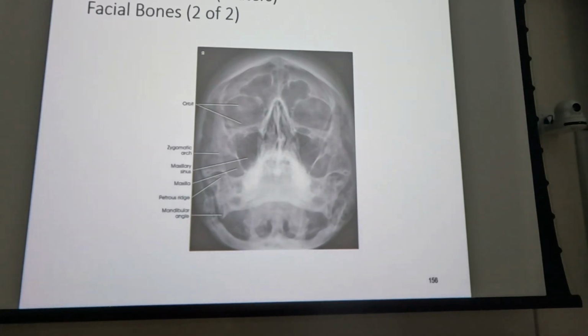Zygomatic arch. So can you see zygomatic arch on this? The answer is yes. So you could diagnose a lot of stuff just off this one view. Frontal sinus infection, maxillary sinus infection, the evidence that the patient might have a blowout fracture, deviated nasal septum. It's not going to show broken nasal bones. It's going to show tripod fracture, and it can show zygomatic arch fracture as well. Okay, and as a bonus, we can see the dens. So positioning is an awful lot like our Fuchs, right? Only this one is useful.